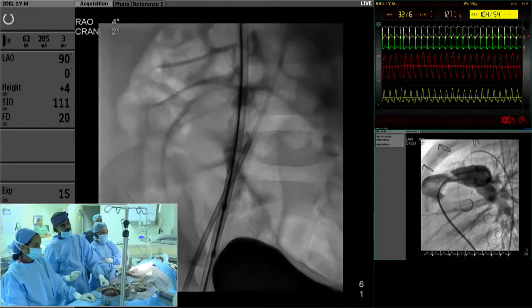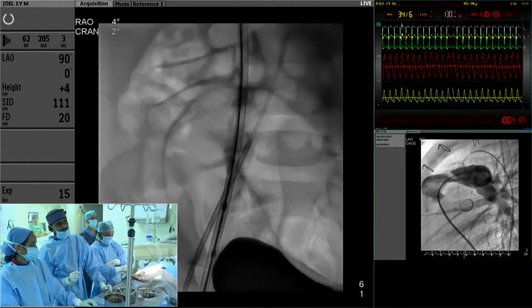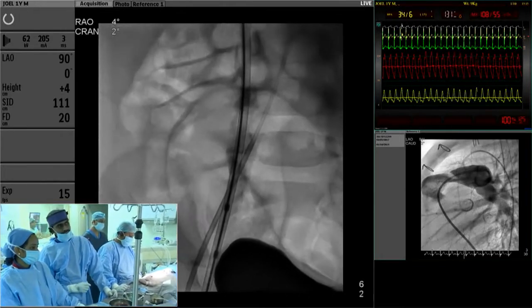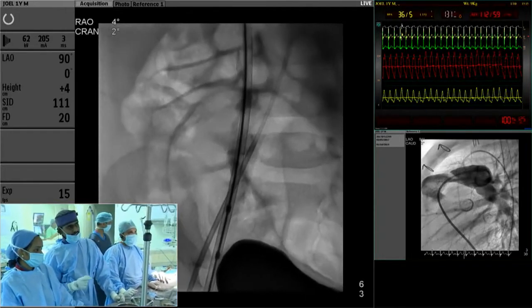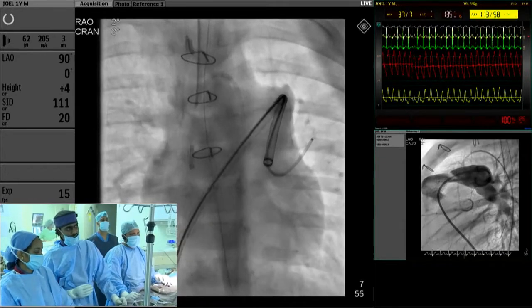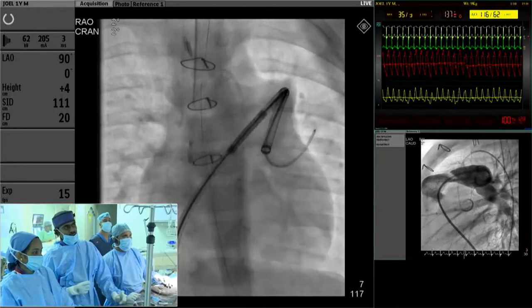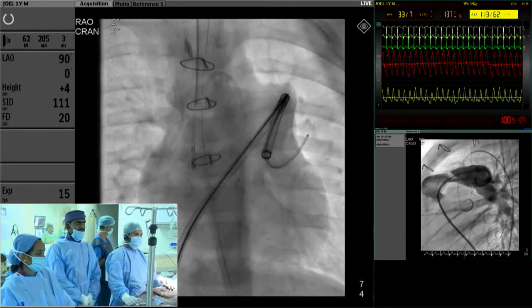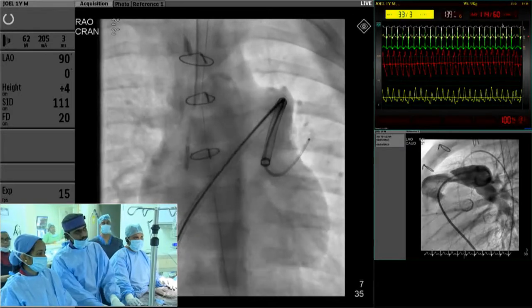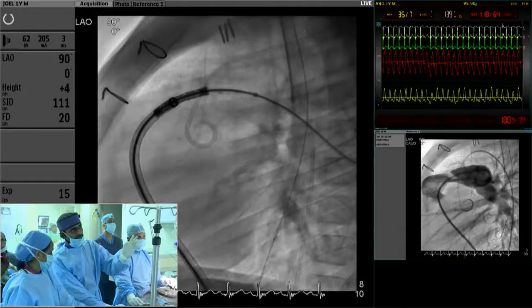We found that the balloon alone was entering the sheath because the stent was caught in the check flow valve of the Flexor sheath. So subsequently we got it rectified. We inflated the balloon a little bit to grip it, and this is the stent. This is a 12 millimeter by 2 centimeter Opta balloon with the Formula 20 millimeter long stent.